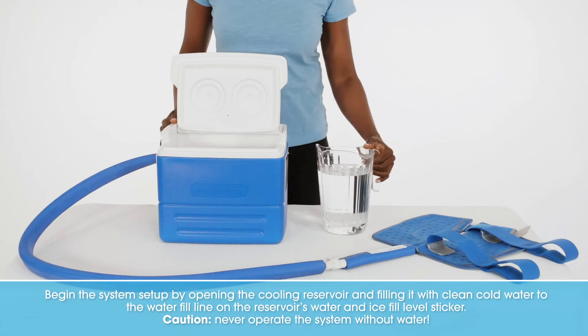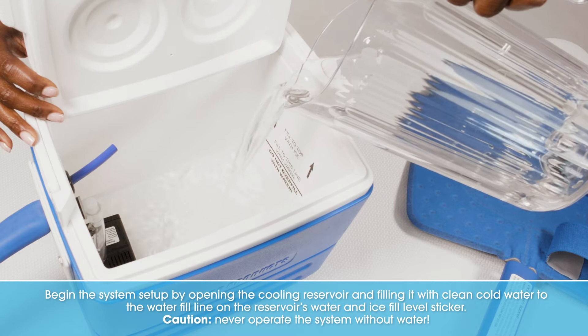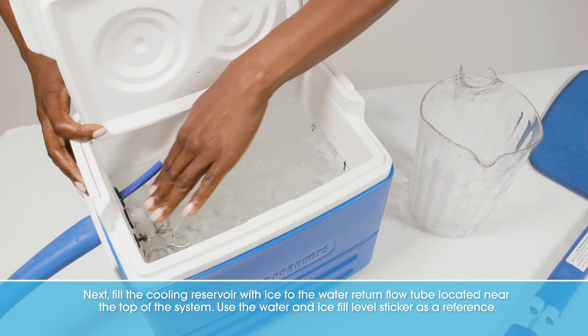Begin the system setup by opening the cooling reservoir and filling it with clean, cold water to the water fill line on the reservoir's water and ice fill level sticker. Caution: never operate the system without water. Next, fill the cooling reservoir with ice to the water return flow tube located near the top of the system. Use the water and ice fill level sticker as a reference.